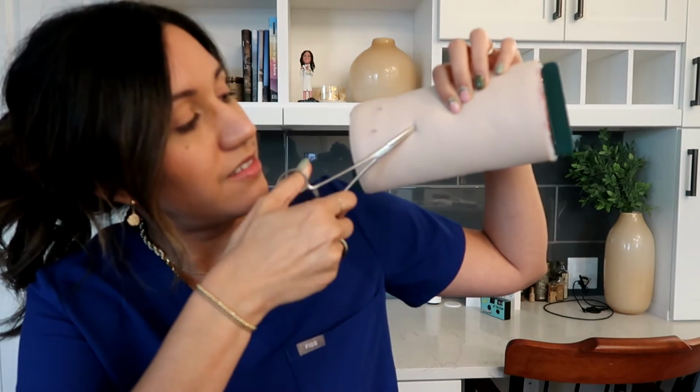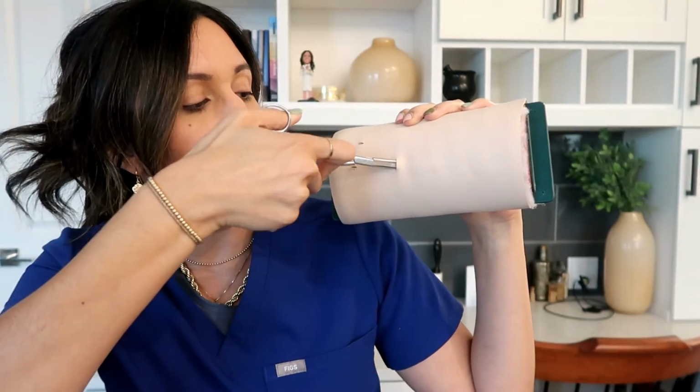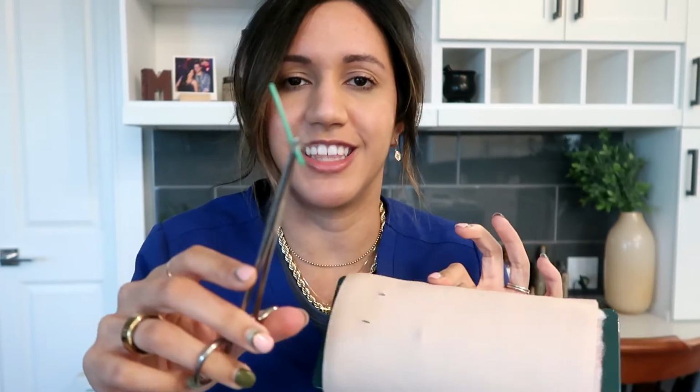Now, a lot of the times, I use this hand to stabilize the backside of the Nexplanon, and then I use this little instrument. We place it right underneath the skin, right until we can feel that Nexplanon, and we remove it. Obviously, this being a model, it makes it pretty straightforward, but everyone's gonna be a little bit different. Sometimes the Nexplanon can become covered in that fat, so it might take a little bit longer for us to get it out. Again, this should never be super painful or uncomfortable. You should just really feel the pressure. So sometimes we may place the instrument in and start kind of trying to feel for exactly where the Nexplanon is. We feel it, lock our instruments, and remove. Well, some fuzzies came out with this one, but don't pay attention to that, it's just the model.